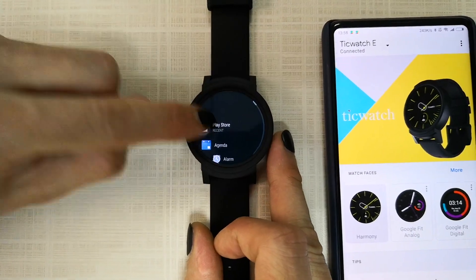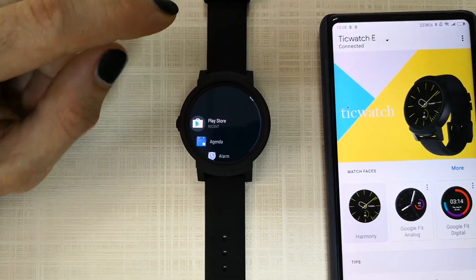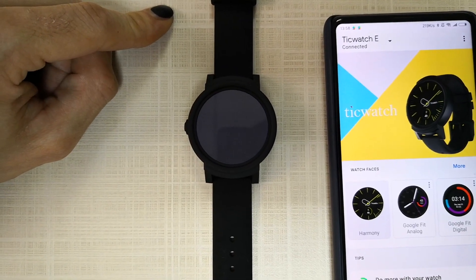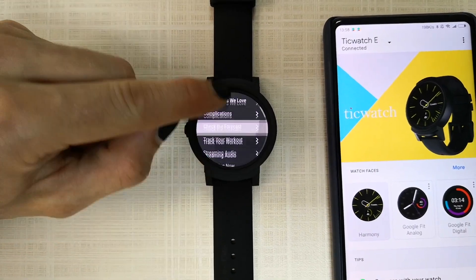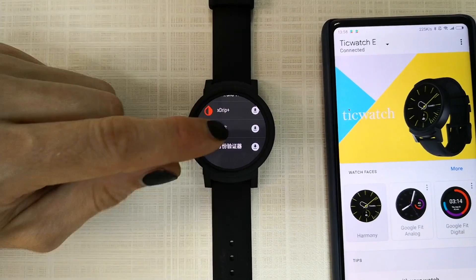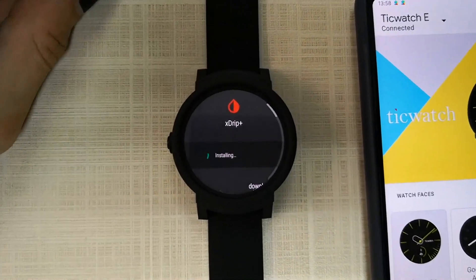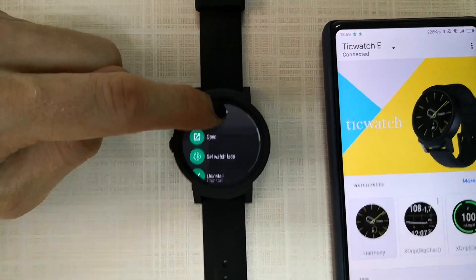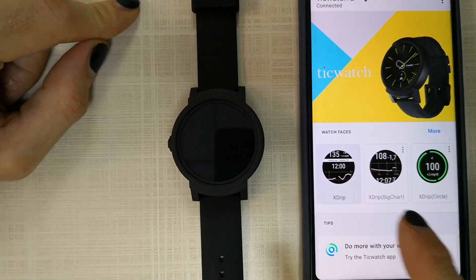Open up the Play Store. If you scroll down you will find xDrip Plus — press install. After this you will see the app is installed and you can set the watch face. You will also see the watch face on your phone.